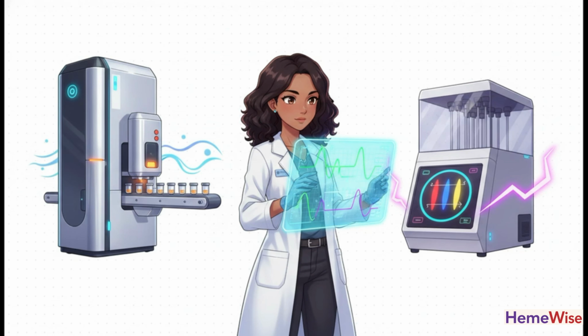When we put these two powerhouses side by side, we see HPLC is phenomenal for rapid, automated quantification of hemoglobin A₂ and F. But capillary electrophoresis is often way better at separating certain tricky variants, like pulling hemoglobin E away from hemoglobin A₂. Neither machine is universally superior.